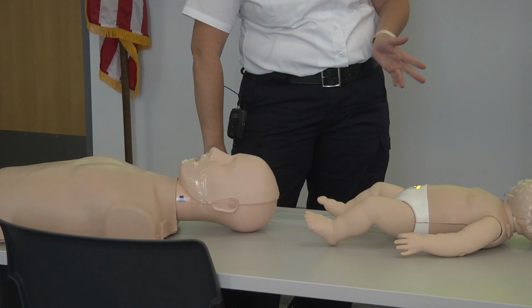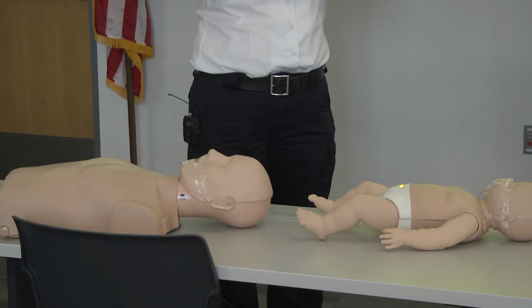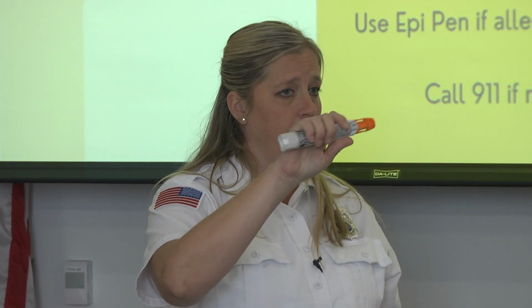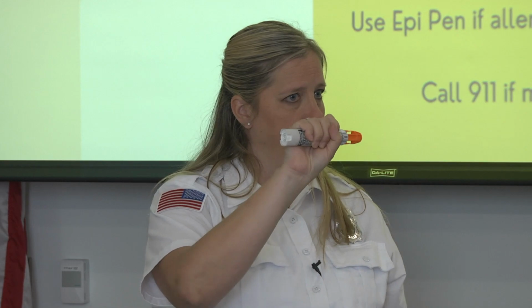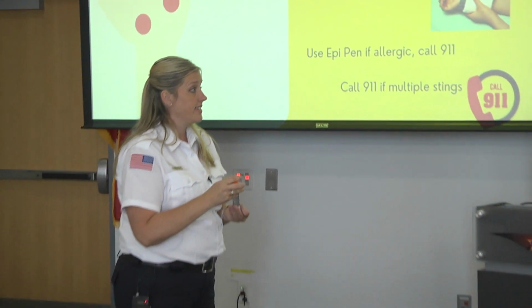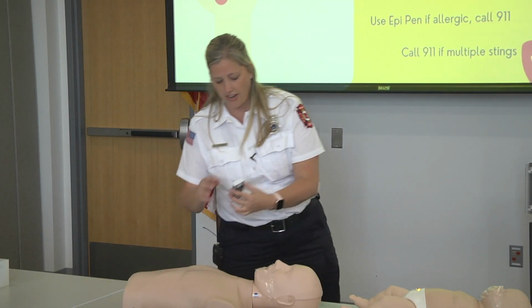I'm going to hold it for 5 to 10 seconds, and then I'm going to release it. When it releases, this part is now over the needle, so you shouldn't have to worry too much about that. Just always be careful anytime a needle is involved. Okay. So that is this EpiPen. I have another one that I can show you here really quick as well. And this one's called the Auvi-Q.